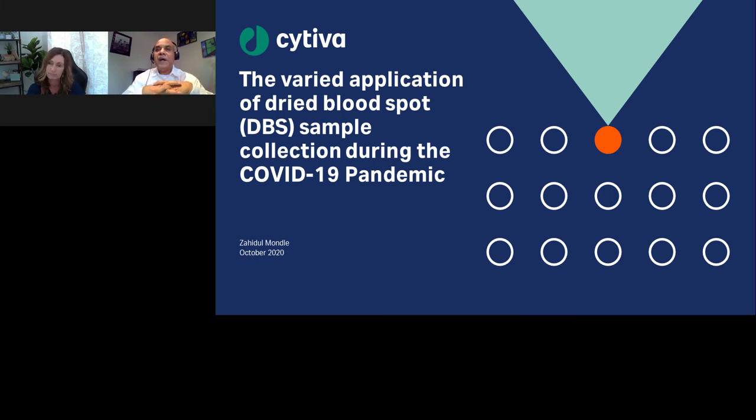For example, the touch of a finger to verify the location of a vein before insertion of the needle increases the chance that a specimen will be contaminated from the hands. And these can cause false results, prolong hospitalization, delay diagnosis, and cause unnecessary use of antibiotics. Also, jostling and jarring of the test tubes in transit can lyse or break open red blood cells, causing false laboratory tests as well.